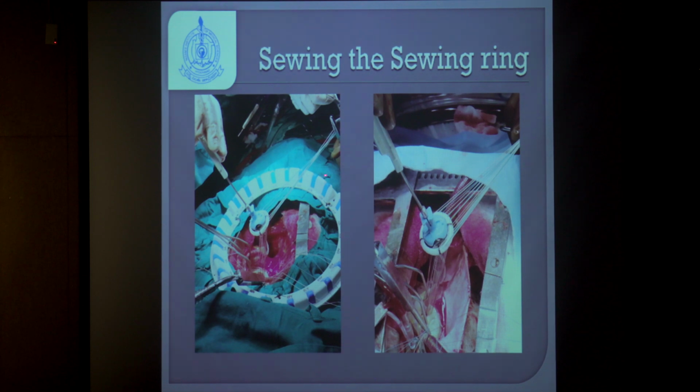These are the suture guides that I was talking about, which help us in placement of the sutures and guide us to the next suture.